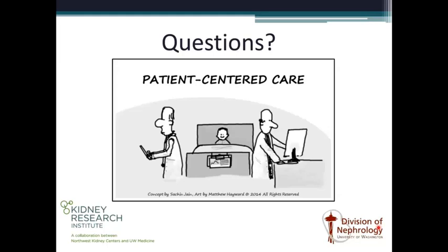Yes, because if you do it enough times, you just get immunized to it. Yeah, so that's actually not been borne out, and people's technique can be very difficult to correct. I would argue that's probably a much simpler... I mean, we can barely train our medical students, and the nursing staff takes hours to train them how to do blood pressures correctly. So I think it is more complicated than it seems at first.